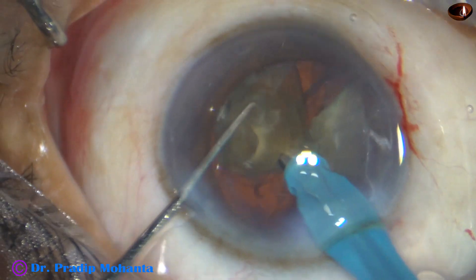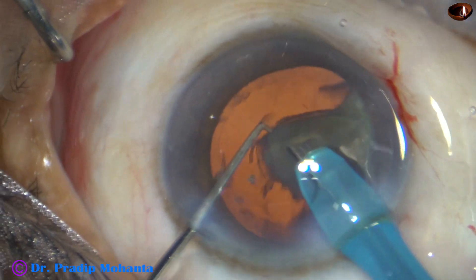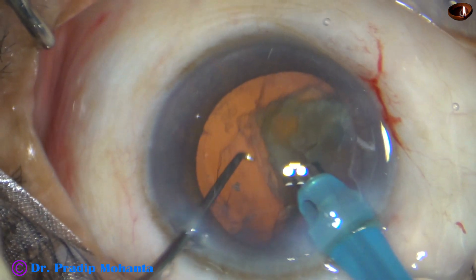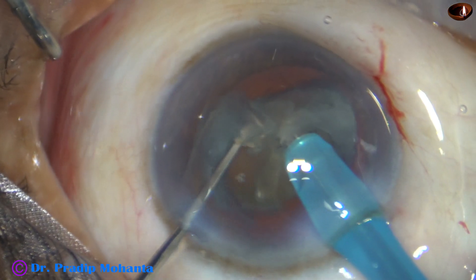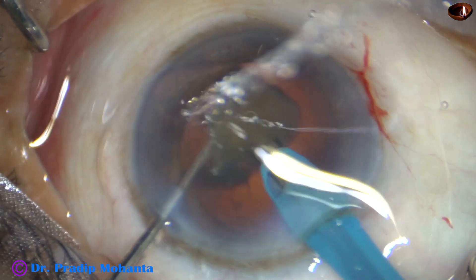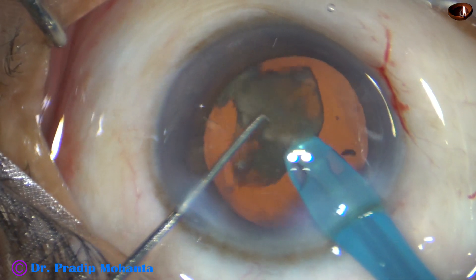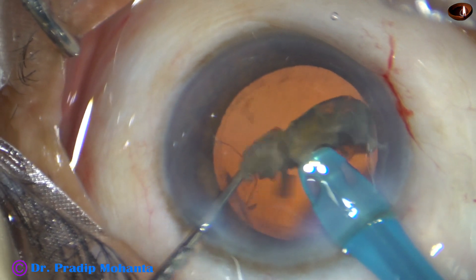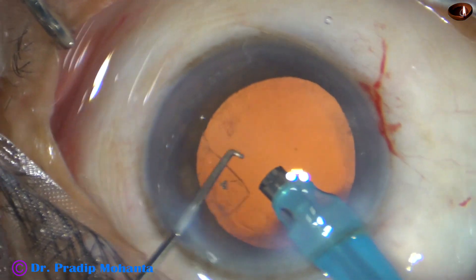Now this is the third nuclear fragment — it is emulsified. The parameters: ultrasonic energy used is 85%, flow rate is 45 ml per minute, vacuum is 450 mmHg. This is the Phacо from Oertly, but the surgery can be done with Oertly AC or Oertly Cataracts 3 in the same way.